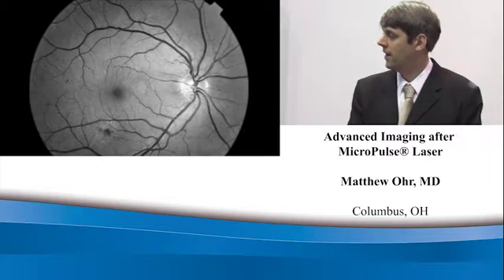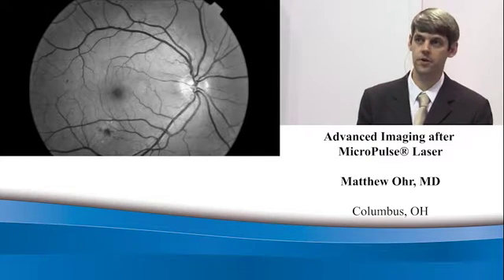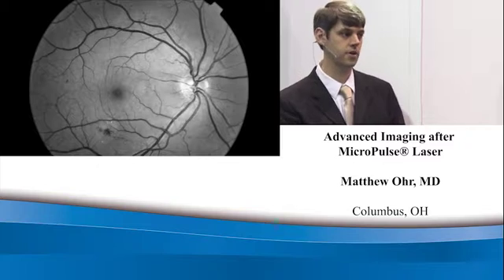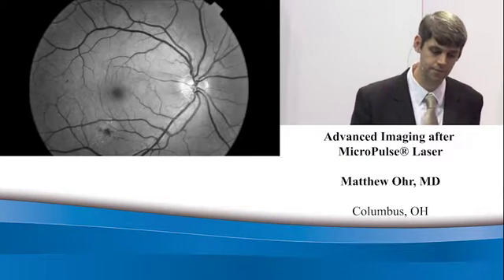So again, the way that I treated this patient is with a confluent laser that looks just like this, 7x7 grid. Now, in full disclosure, currently now, I treat with a more aggressive treatment. I would actually probably use at least 4 of those same grids. But when I was first starting out, this is the treatment I used for him.